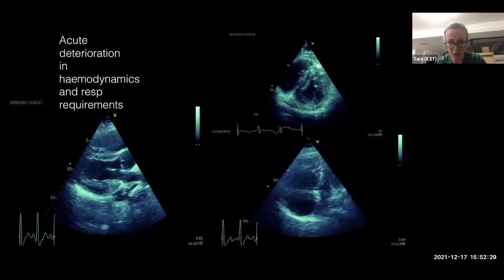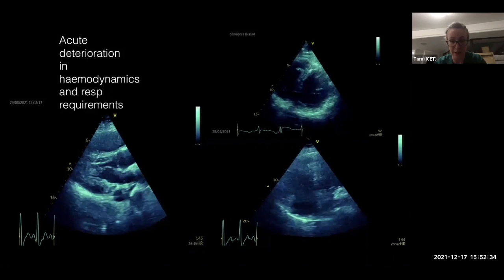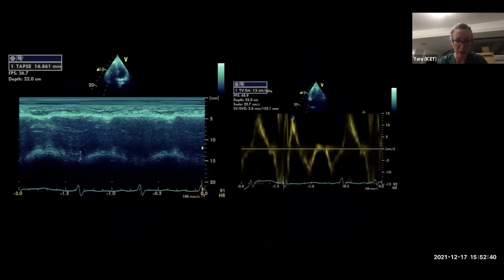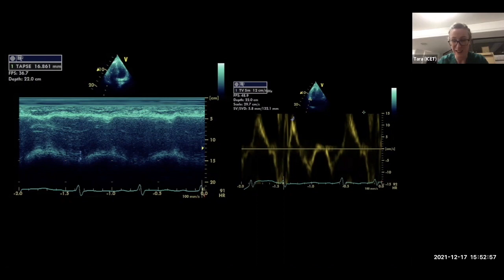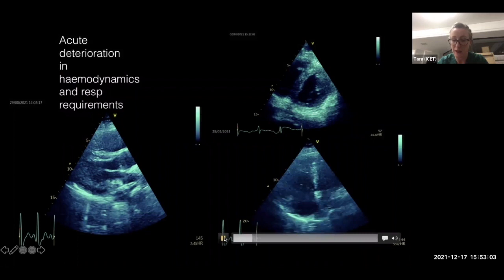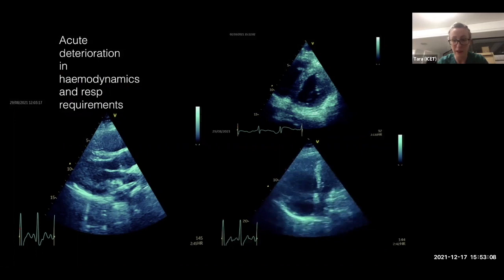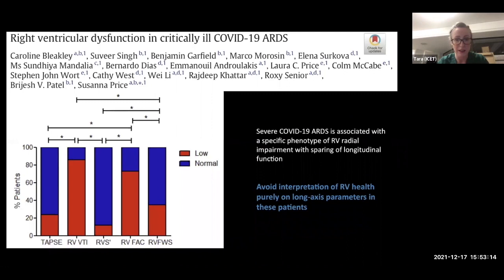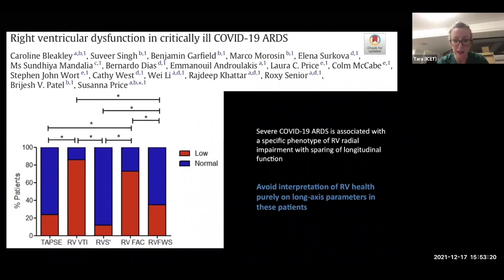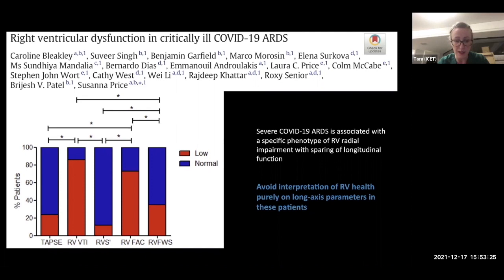This is a severely dilated, severely dysfunctional, pressure and volume-loaded RV — remarkably, this patient had a normal RV just two days prior, demonstrating how quickly this can develop. Importantly, the longitudinal systolic function numbers for this RV appeared relatively normal, yet look at what we're seeing on screen. This highlights a critical point: never take a single value at face value; always look at the whole heart. This reflects radial impairment with sparing of longitudinal function, which we've seen frequently at our institution.